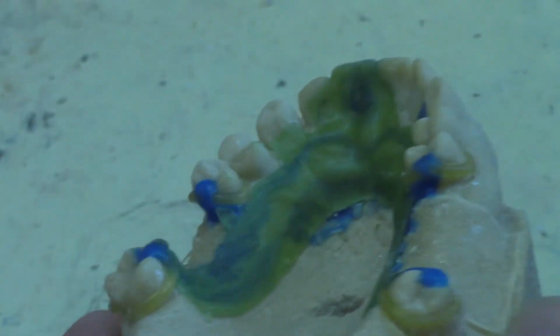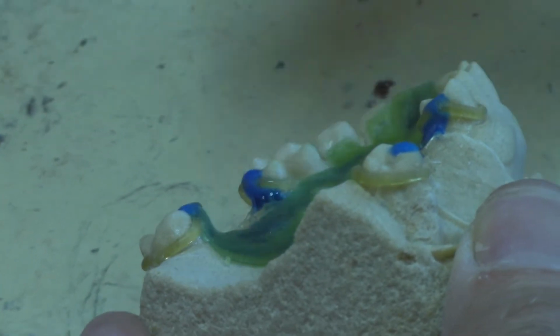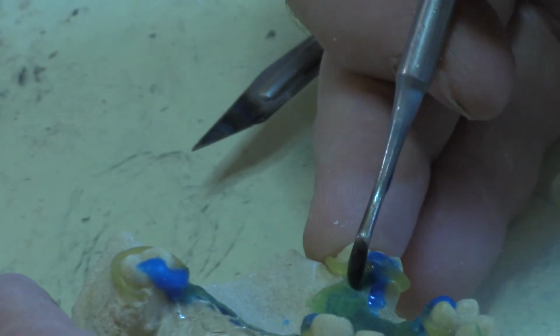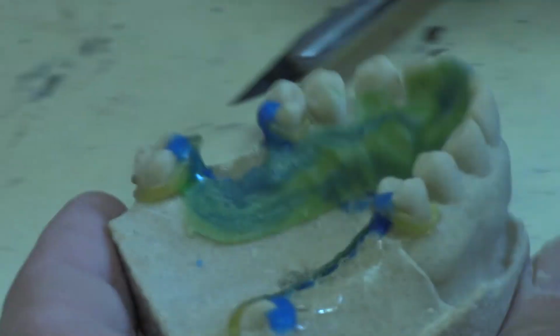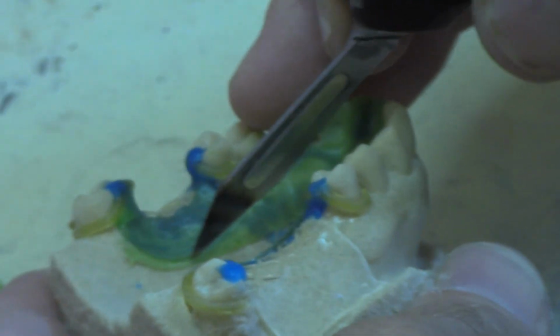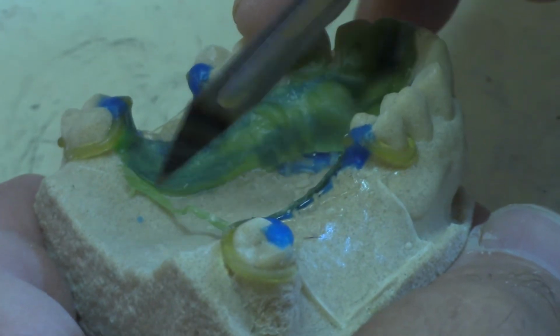I'm going to do the same thing over on the other saddle. Right here. Join that. Okay, then I can just melt that. Seeing as my patterns are wax, this horseshoe pattern is in wax. The clasps are all plastic, so I can't melt those, but I can melt this base. Now if I want, I can trim a little closer. Save me some metal trimming later.